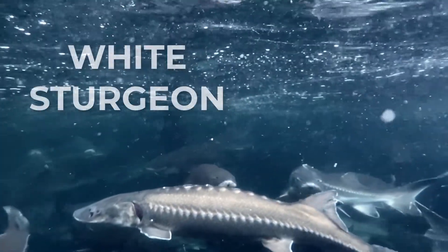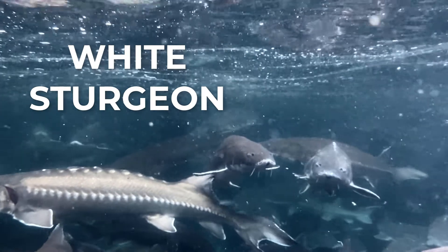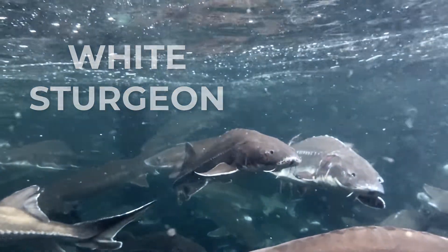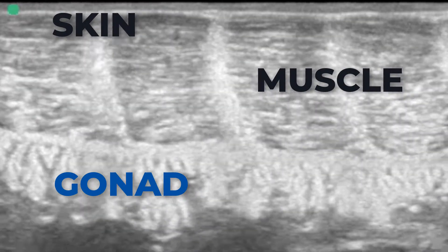Did you know it could take seven to ten years to harvest caviar eggs from a female white sturgeon? Since it's impossible to identify the difference between the sexes by just looking at them, how then do we ensure we are only raising female fish? In this video we're going to show you how aquaculture has been pioneering the use of ultrasound to help you determine the sex of your fish.